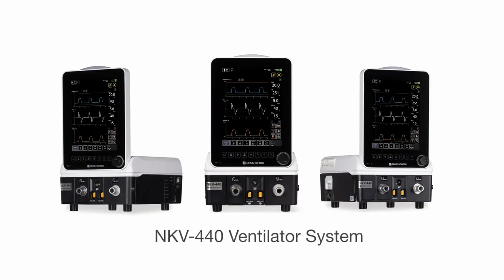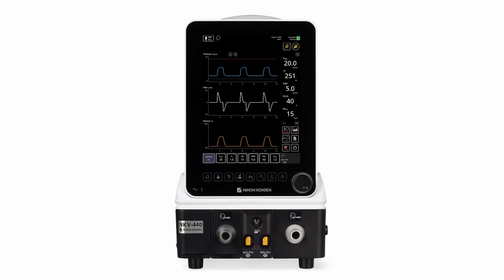The NIHON KOHDEN NKV 440 ventilator system is intended to provide continuous ventilation for adult, pediatric, and neonatal patients who require invasive or non-invasive respiratory support.